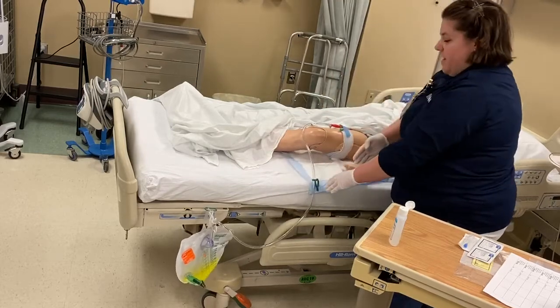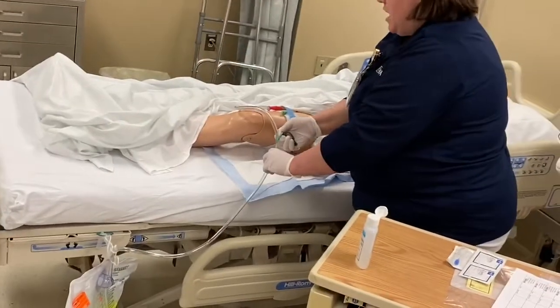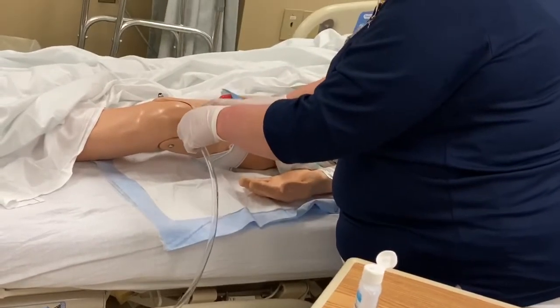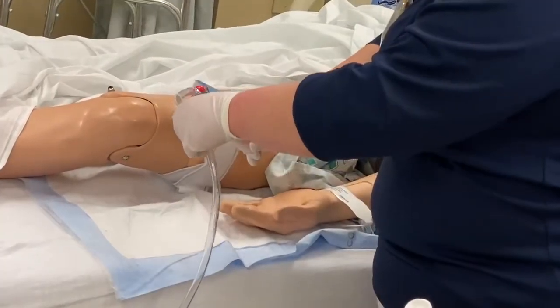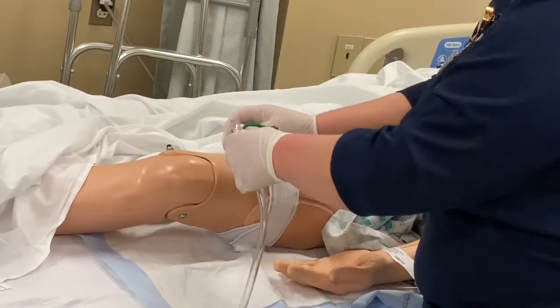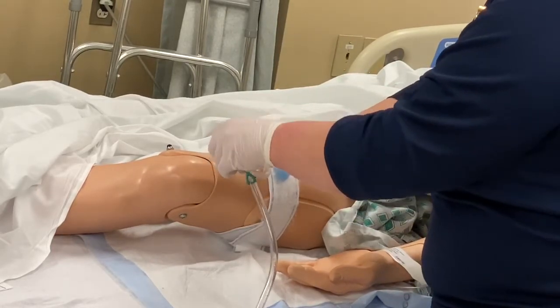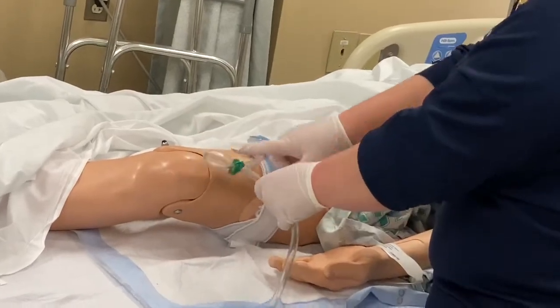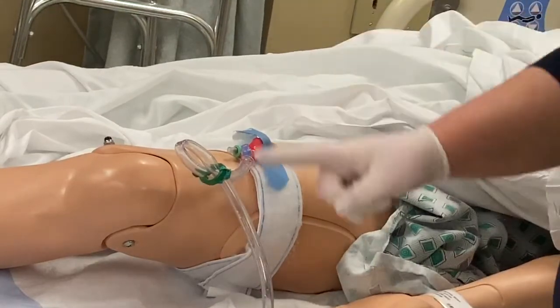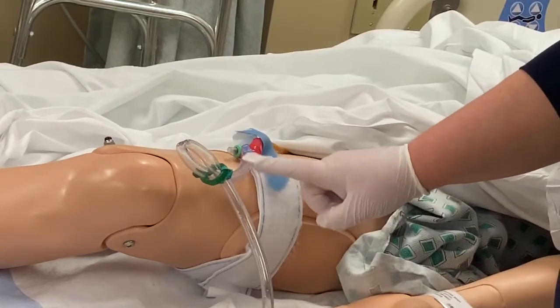So, after I've emptied all of the urine from the tubing, I'm going to take this green clamp and I'm going to bring it up here towards the port. I want it to be a few inches away from where the port is, and I'm bringing it up to eye level so that I can see this clamp and then I don't forget it later. I'm going to pinch my tubing, and I'm going to place this clip around the tubing. So what I've done right here is I've provided a kink that's gonna stop the urine from flowing into the bag so that I can gather all the fresh urine that is created by my patient.